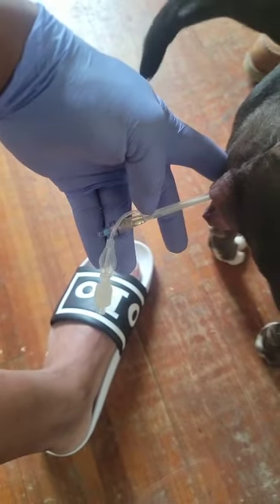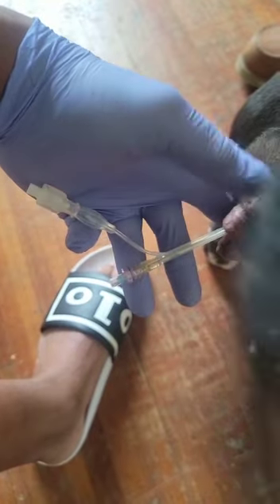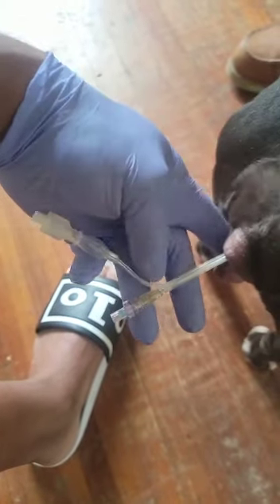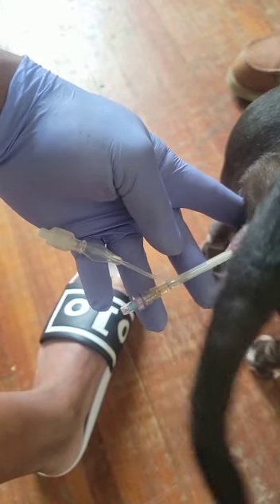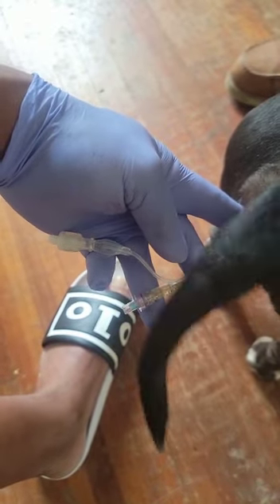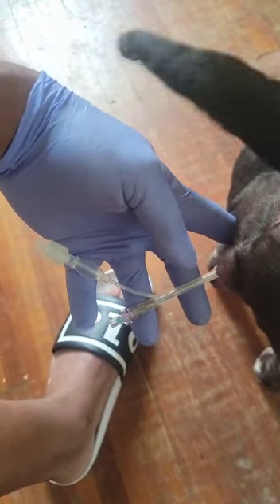The AI kit here — I'm mad that I flushed my straw still because I put the rest of it in the AI too. But look, see that little part of it? At the end of the AI, it looks like the regular straw, but at the end of the AI, that part of it — you hook up another syringe to it with air in it.